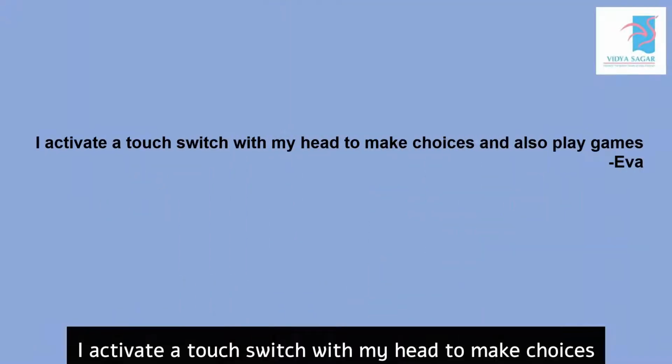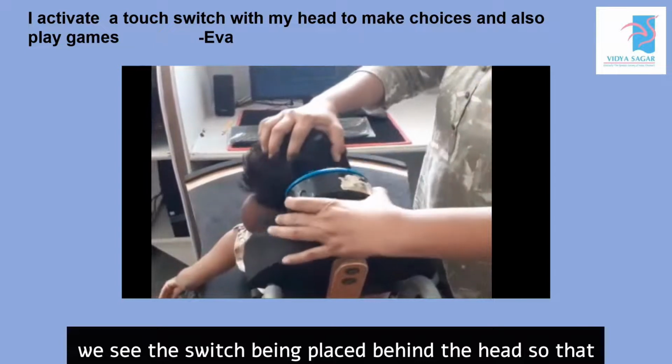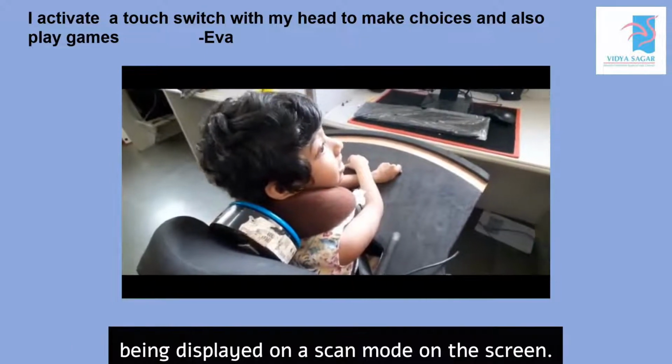I activate a touch switch with my head to make choices and also play games. In this video, we see the switch being placed behind the head so that it becomes an easy activating point to make selection being displayed on a scan mode on the screen.